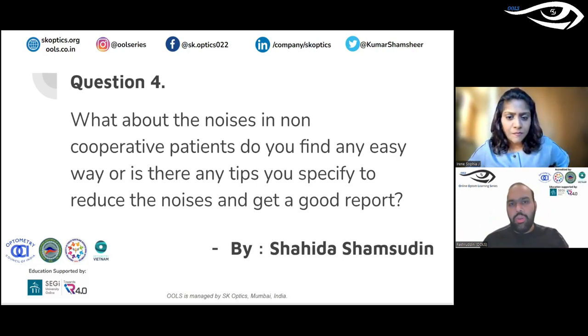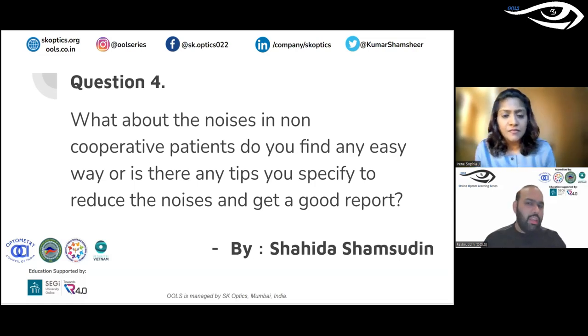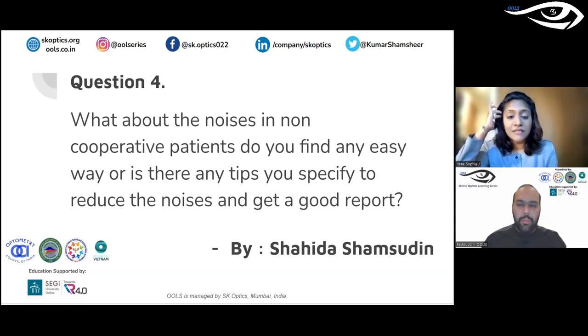Would you like to do them again? Would you like to do multiple reports or anything? Yes. If there's a lot of noise or for some reason you don't get a good impedance and if there's a lot of artifact, then definitely we have to repeat it. Okay. Because otherwise it's not going to be a reliable report.